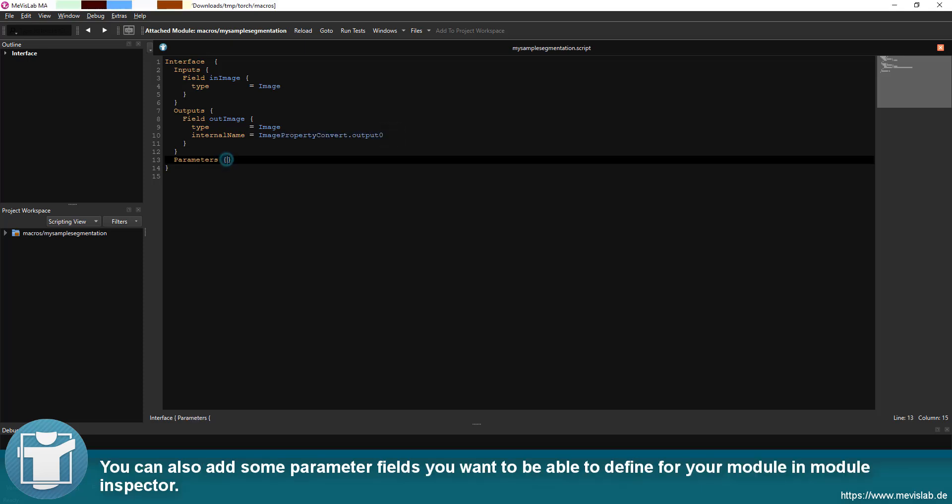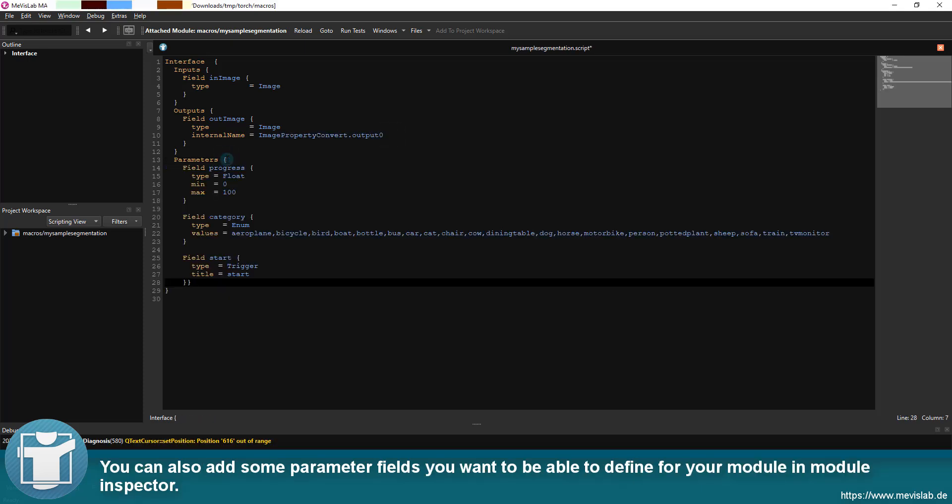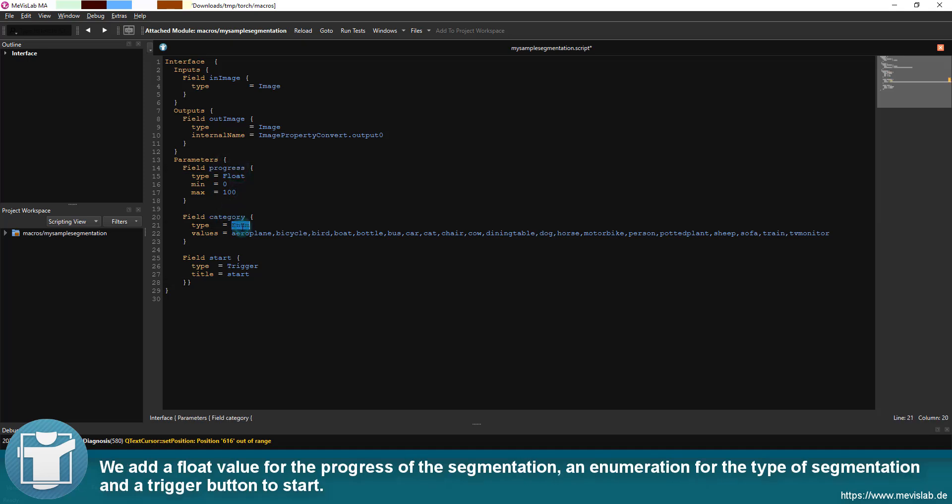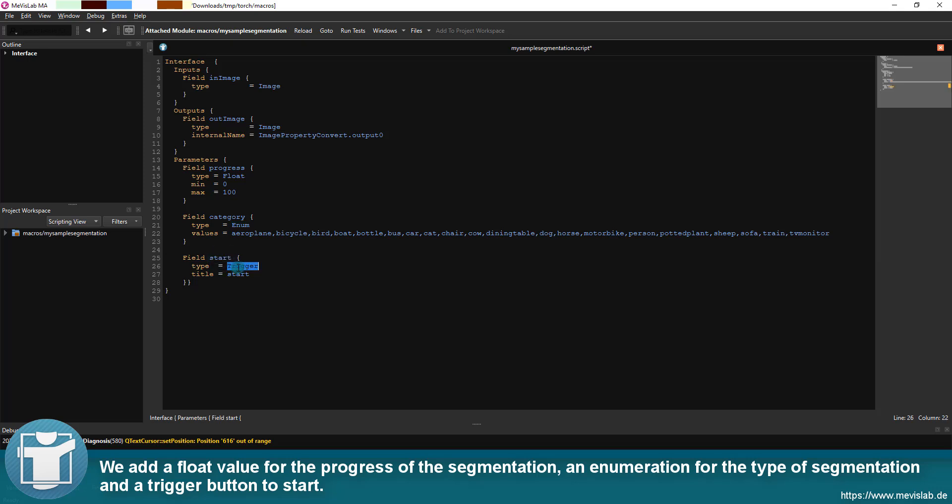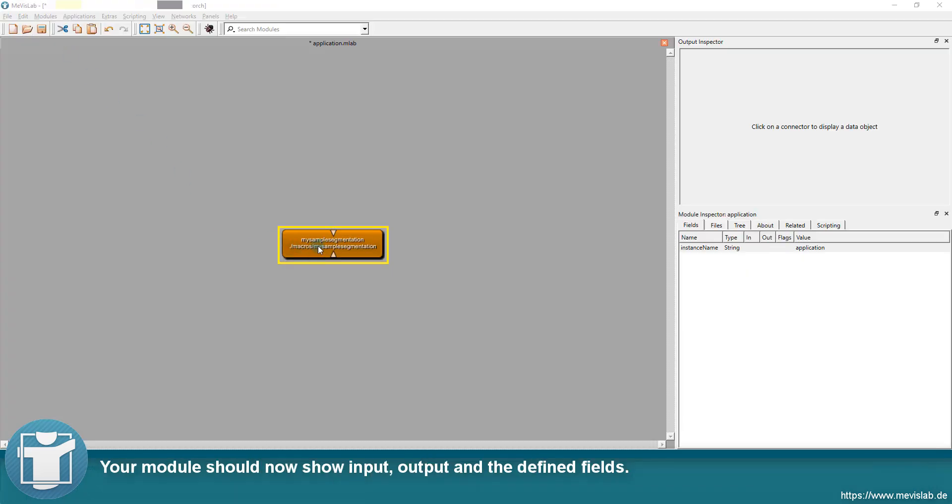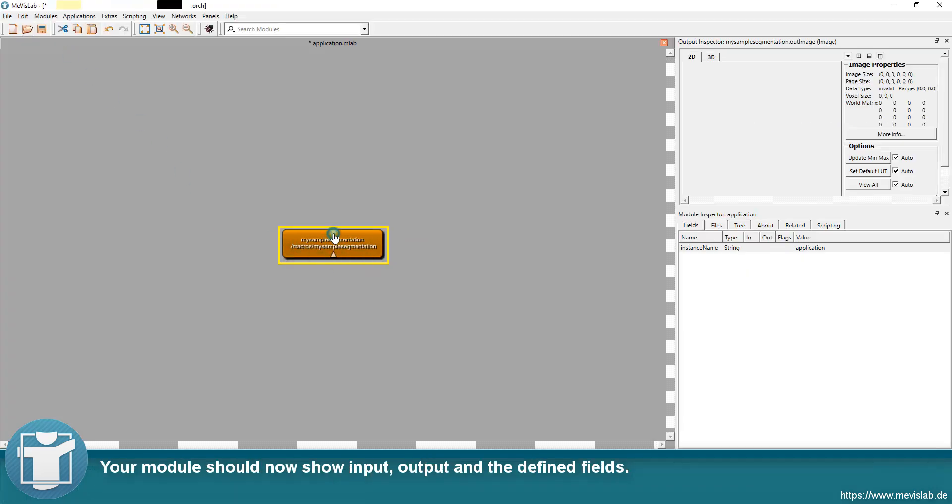You can also add some parameter fields you want to be able to define for your module and module inspector. We add a float value for the progress of the segmentation, an enumeration for the type of segmentation and a trigger button to start. Your module should now show input, output and the defined fields.